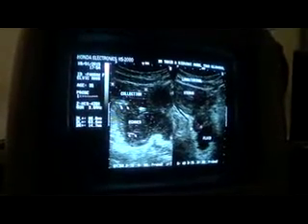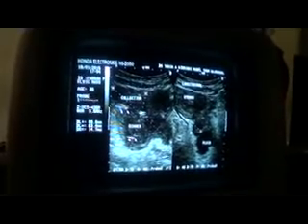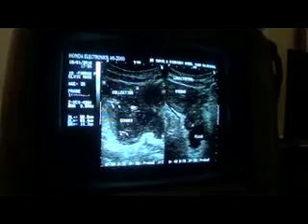So this is our case of the day, that is, collection in the pelvic cavity extending into the right adnexa and then up to the region of the right iliac fossa because of intrauterine intervention to induce abortion. Thank you very much.